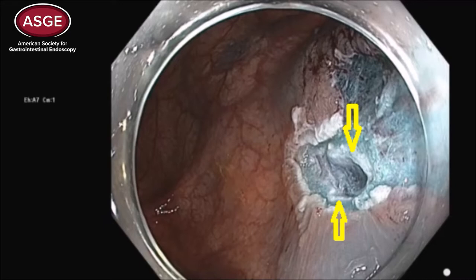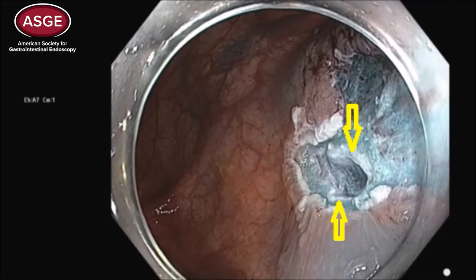You have to recognize this and reinforce it — close it basically with clips — or there is risk of a delayed perforation.